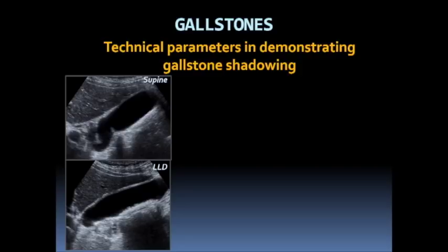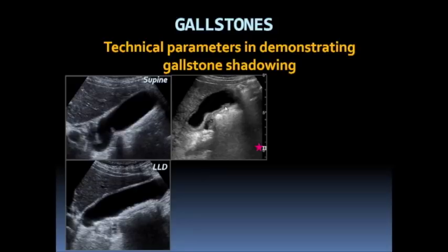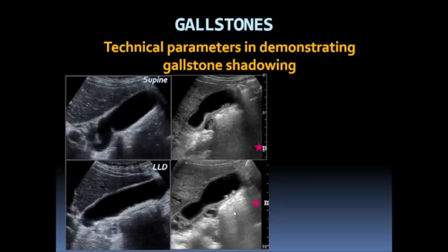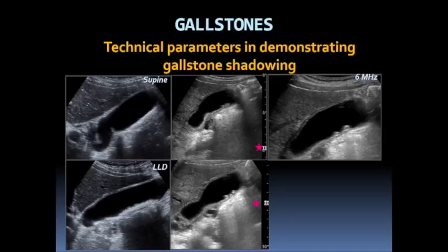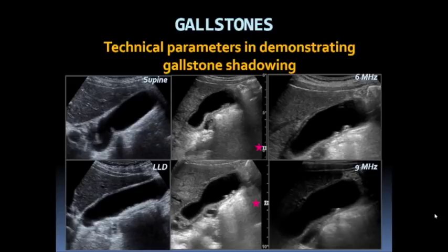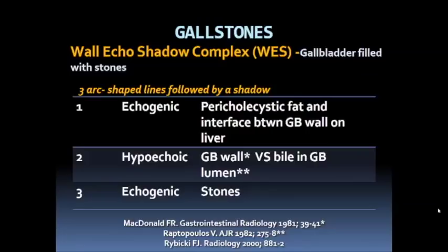A different patient with luminal echogenic contents: when the focal zone is intentionally set away from the gallbladder, there's no clear shadowing. When the focal zone is optimized, we begin to see vague posterior acoustic shadowing indicating a stone. Scanning with a six megahertz transducer shows vague shadowing; with a nine megahertz transducer, posterior acoustic shadowing is clearly demonstrated.